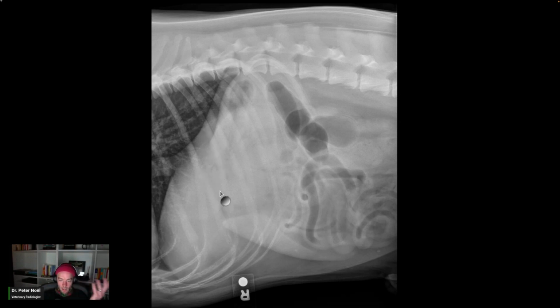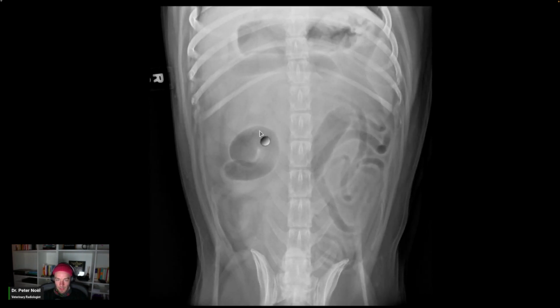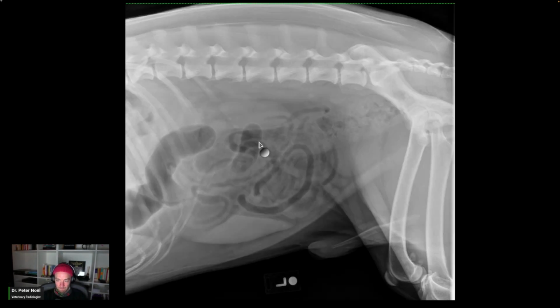So liver, kind of skimpy, a little bit small. Spleen is normal. The kidneys, the left kidney's normal. The right kidney is probably normal. There are no calculi that I see here. That's a nipple. Here's the urinary bladder. I describe this as urinary bladder small and fluid opaque. Left kidney is normal. Abdominal serosal detail is normal.